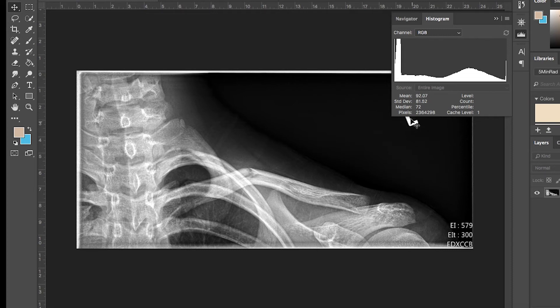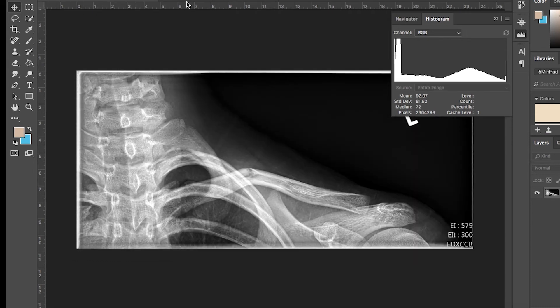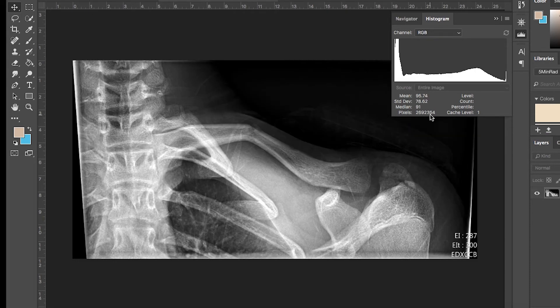You're looking at the median value of 72 here. So for this particular Photoshop system, the lower that number, the darker the average value. Now if you go to the second image, the histogram has shifted a little to the left. I'm going to toggle back and forth between them. See the difference? This one's a little more to the left, but the average value is 91, which is going to be closer to the right.